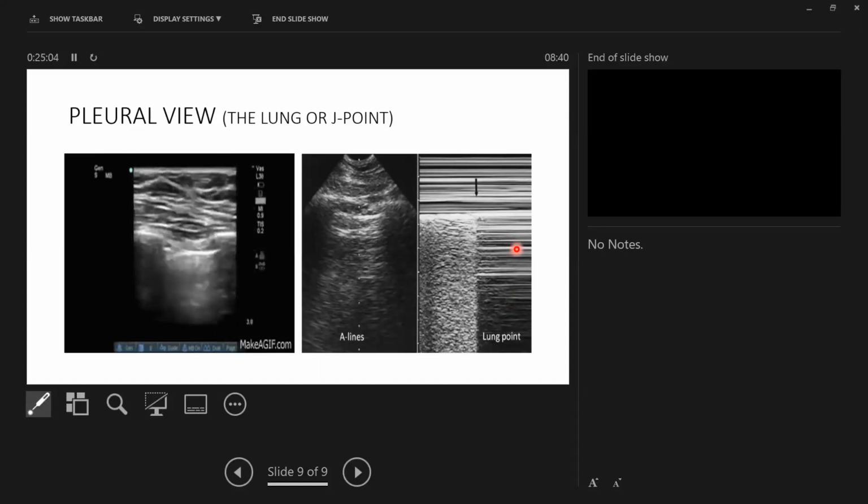So the only way to get used to it is to actually do ultrasounds, all right? Take that machine out of the corner. It doesn't only work on that plug in the corner, it works on all the plugs. Don't worry, I've tried it. So try it, take it out, put it there, put it next to the patient. Patient is complaining of coughing, never mind, do a lung ultrasound for them, just have a look. Because you might start picking up things that you haven't picked up before. You may not know the diagnosis, but at least you can see, something's normal, something abnormal.